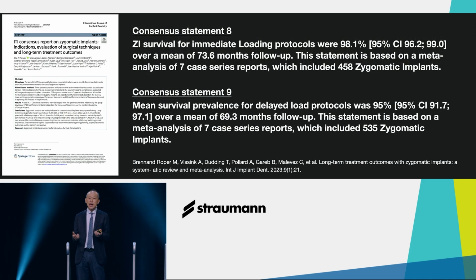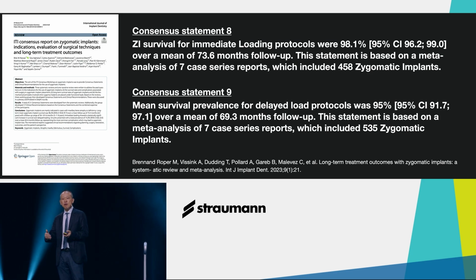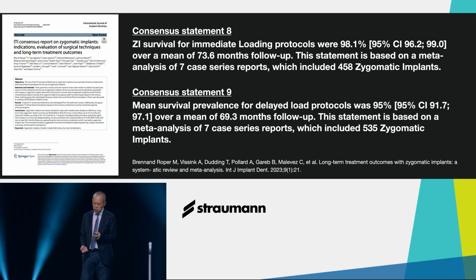And also, we can use zygomatic implants for immediate loading. Again, the survival rate of implants with immediate loading in zygomatic cases is high, and actually it performed better than delayed implant loading.